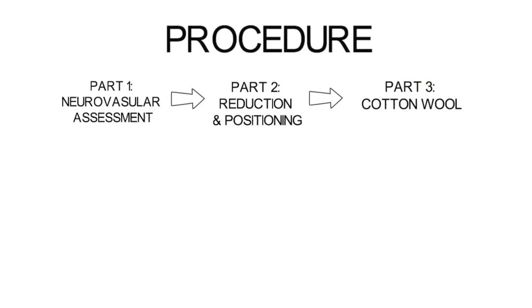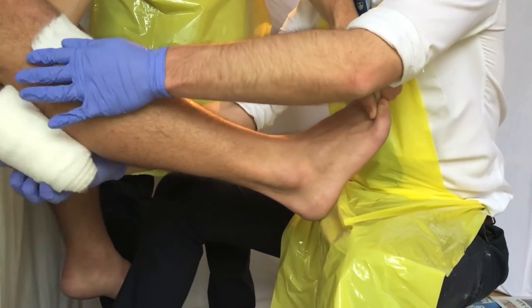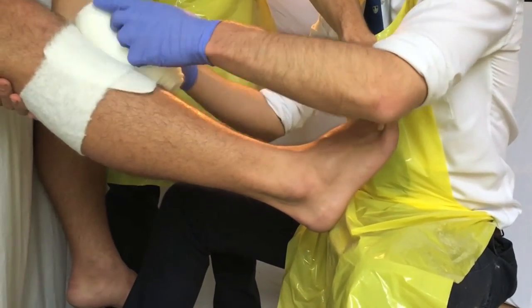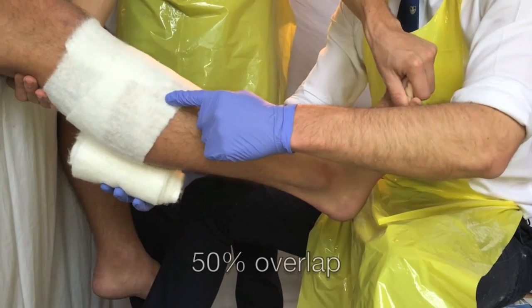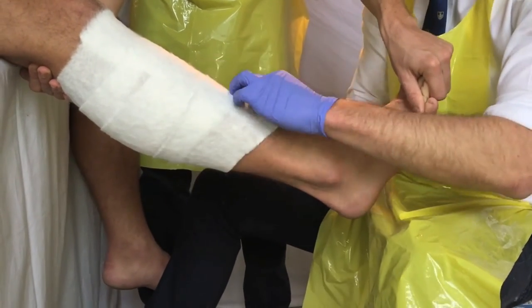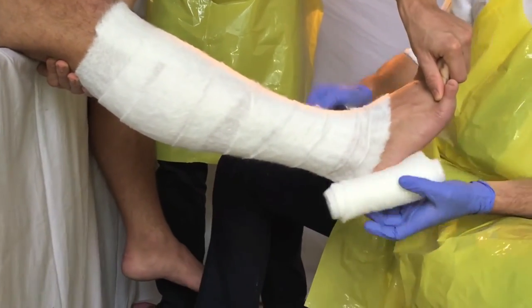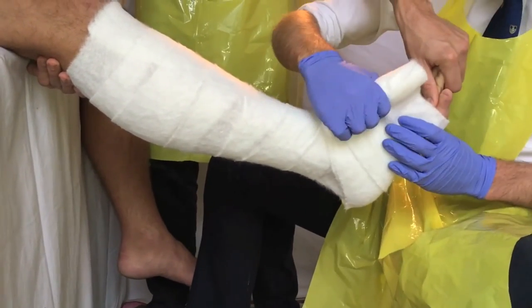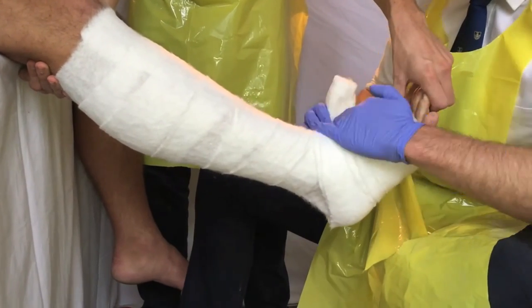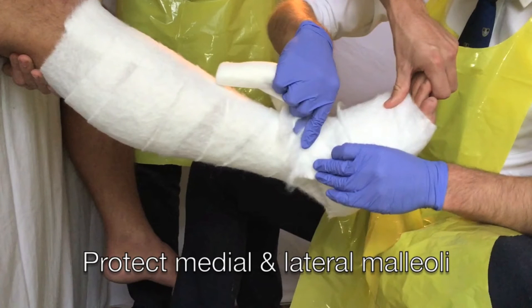The next part of the procedure is applying the cotton wool. Here is a demonstration of applying the cotton wool, starting at the proximal end of the lower limb at the level of the tibial tuberosity. When applying the cotton wool, make sure that you get a 50% overlap between each of the layers. Make sure that you don't apply the cotton wool too tight, and equally don't make it too loose. Ensure that you cover all surfaces of the lower limb right down to the level of the metatarsal heads. Once you have reached this level, break off the remaining cotton wool and add additional protection to the bony prominences, which include the medial and lateral malleoli.